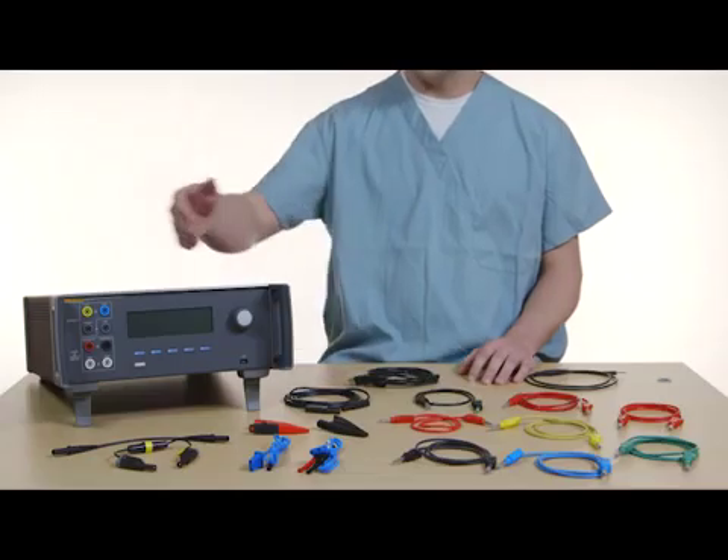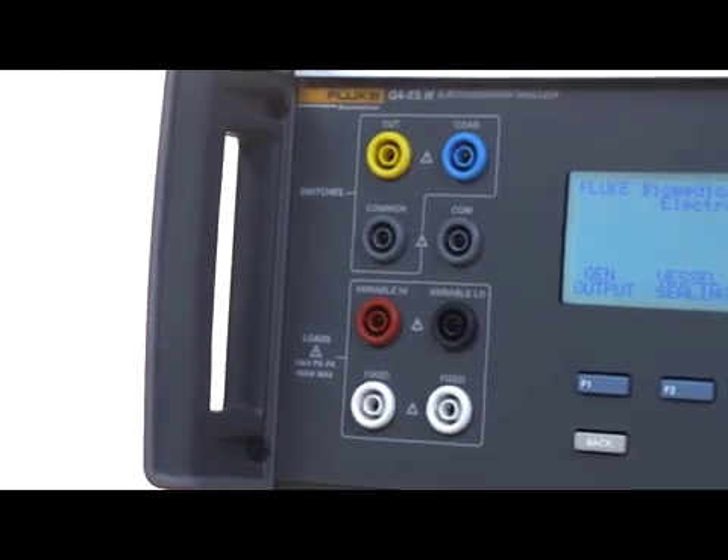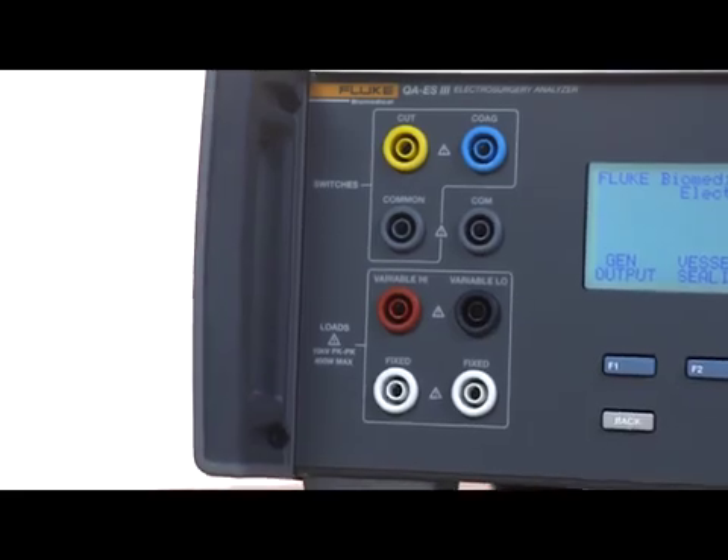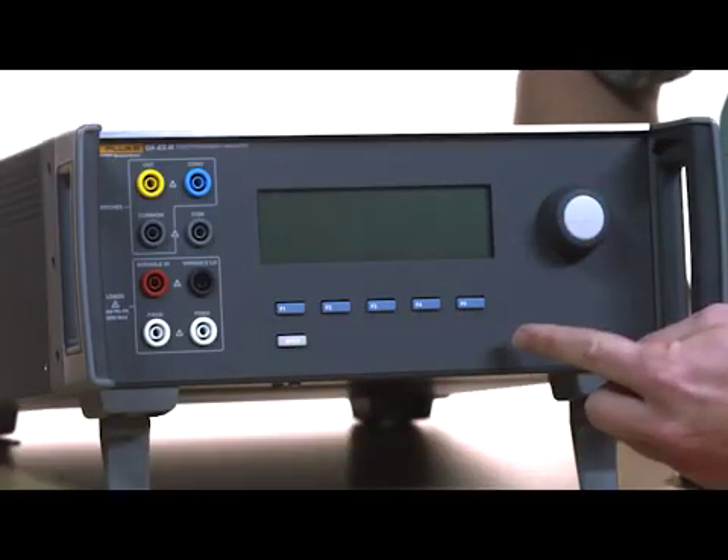At first glance you'll notice the QAES-3 has been redesigned to reduce the number of connections. All of the multi-purpose ports are accessible from the front, along with function keys and the selection knob.